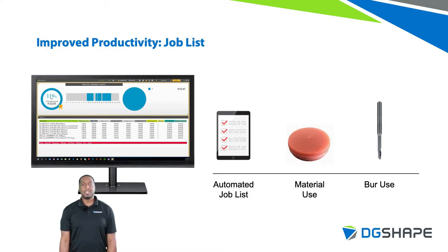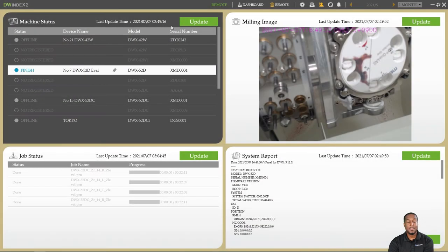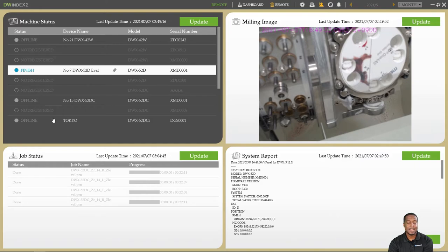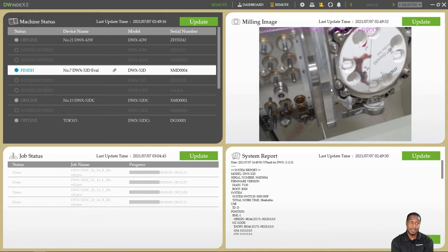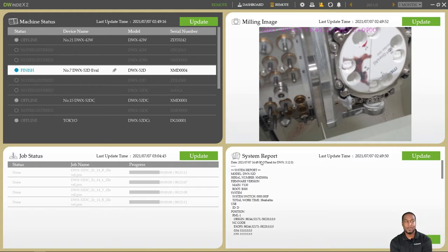Now let's walk through DW Index 2 to get a feel for the user interface. In the Remote section, you will have four different panels. One panel shows the current amount of devices connected to DW Index 2 and their current status. When you select a device, if there are jobs milling or completed, you'll see them in the Job Status section. In the Milling Image section, if there is an attached camera, you'll be able to see a live photo of what's going on in your device. At the bottom right corner, you'll see a system report, which is useful for support cases.